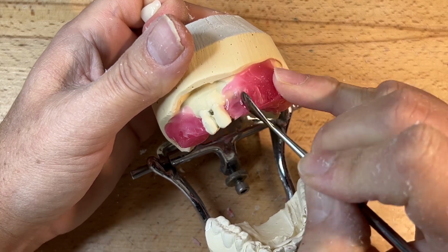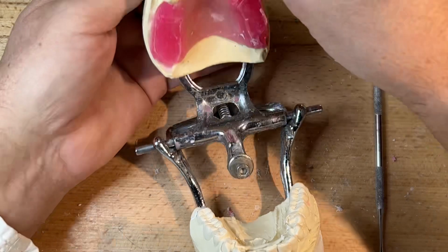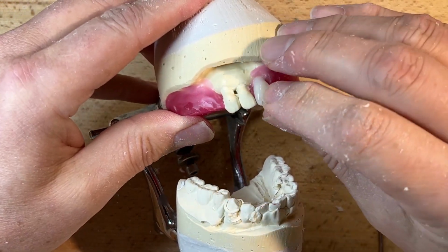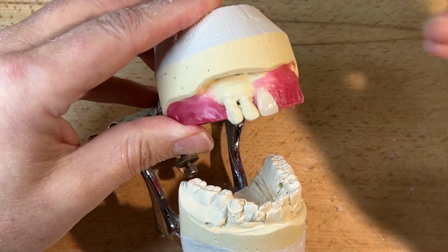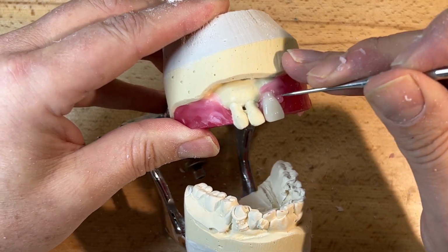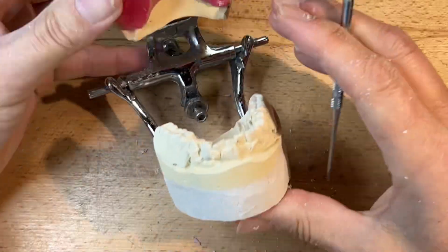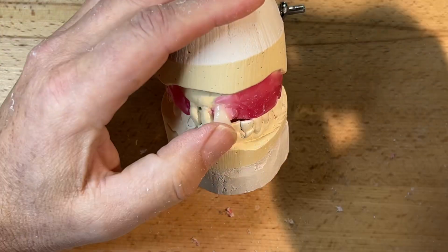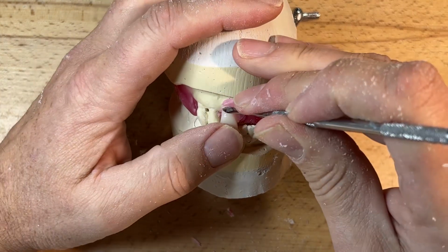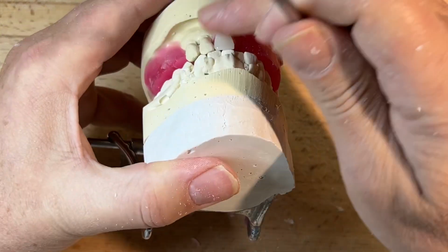So again, I've reduced base plate when I made this occlusion rim for the number one reason: I want to maintain the length and the integrity of the prosthetic teeth. So I don't need any base plate in the way. I see this in error with a lot of dental technicians. They leave this base plate here. It's not necessary. I'm going to need this space to create an emergence angle, or at least I have the freedom to if I wish. But when I have a base plate there, I don't want the base plate to dictate my setup at all.